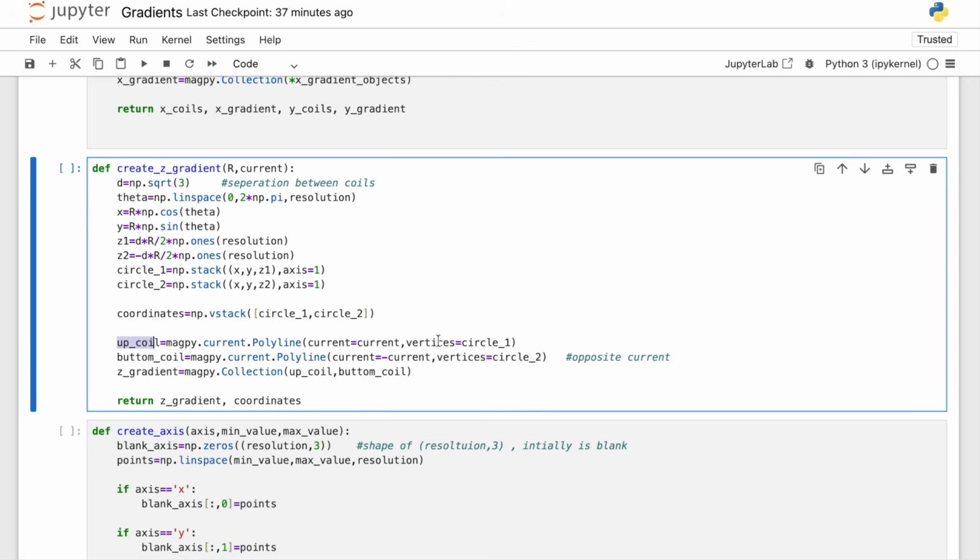The current is the current, and vertices is the circle 1, which was my upper coil. Similarly, I create the bottom coil Magpy object, and then I use the Magpy collection function, which just combines the up coil and bottom coil and returns a single magnet, which is composed of 2 coils. Finally, I just return the z gradient, which is a Magpy object composed of 2 other Magpy objects, and coordinates, which is just a numpy array of coordinates, again in shape of n by 3.